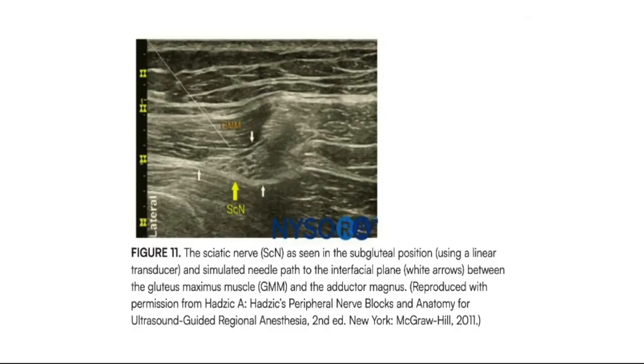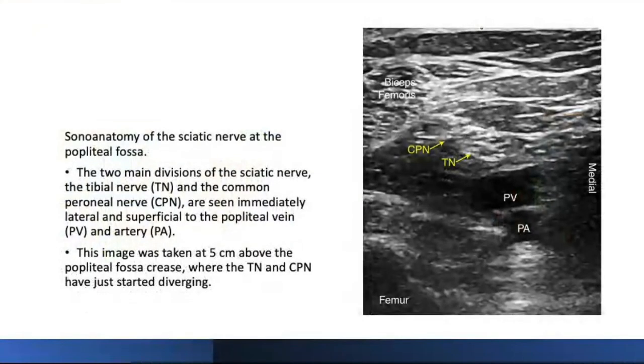There is another technique described where people do popliteal nerve blocks with an out of plane technique. There is an advantage to an out of plane popliteal sciatic. Can you just show the image of the popliteal? If you do an out of plane technique for a popliteal nerve block, you can directly put the needle in between the two nerves, and there's a good chance that you may be able to do just a single injection with an excellent spread. That's an advantage of the out of plane.